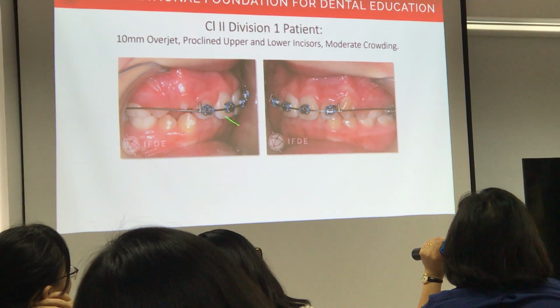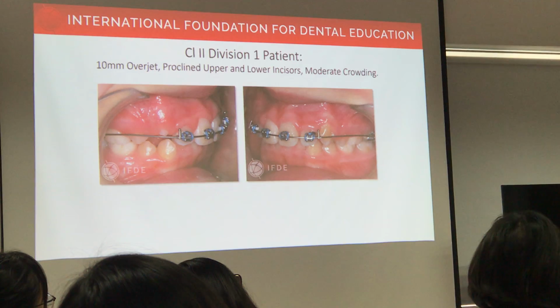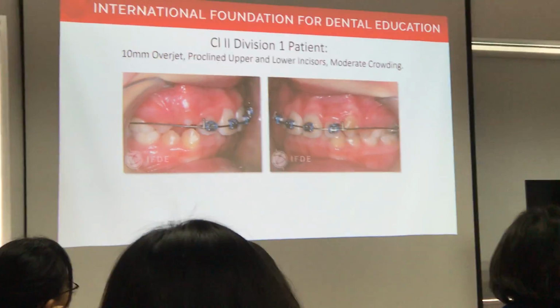So we do a lot of these in my school for people who have no money. It works like a charm. Headgear 2x4, have a nice day.